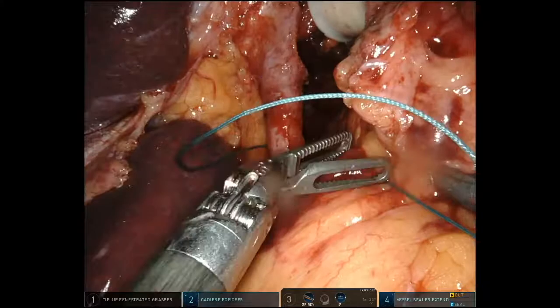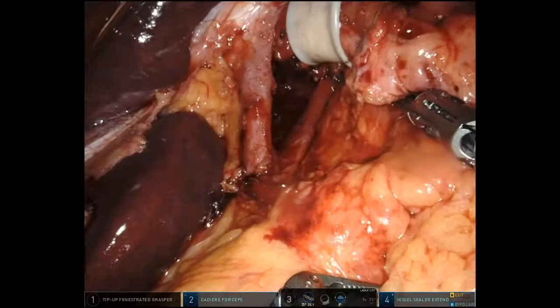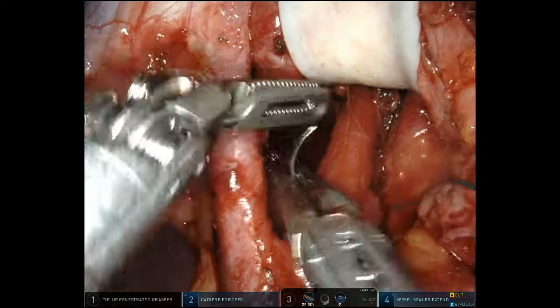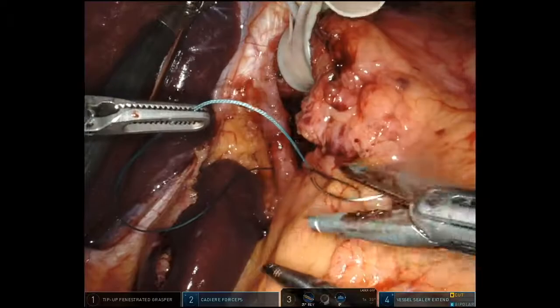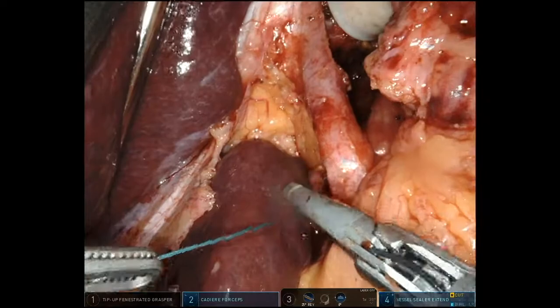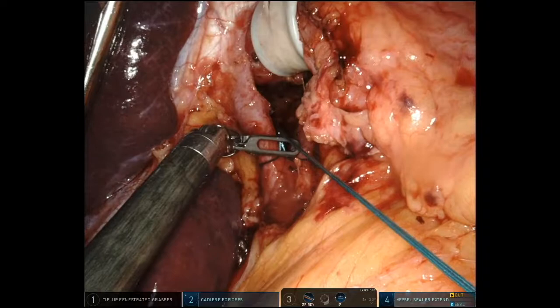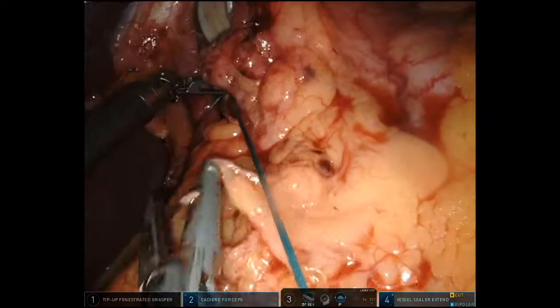I don't use any pledgets on these — they can get in the way. I'm gentle about how I manipulate the stitch; I kind of feed the stitch to my assistant. We're going to tie it using the TK knot pusher — the table-side assistant does that — and I think it's a very secure knot. You can do intercorporeal, but I use the vessel sealer extend as a needle driver; it actually works as well or better than the robotic needle driver and you don't have to open a new instrument, plus it has a cutting function for suture cutting. I pass that to the table-side assistant, feeding the suture in the same direction as the muscle fibers rather than a shearing direction.